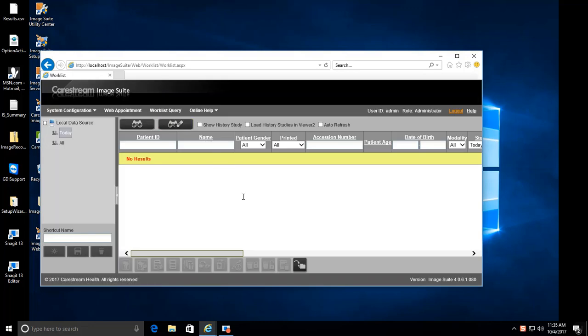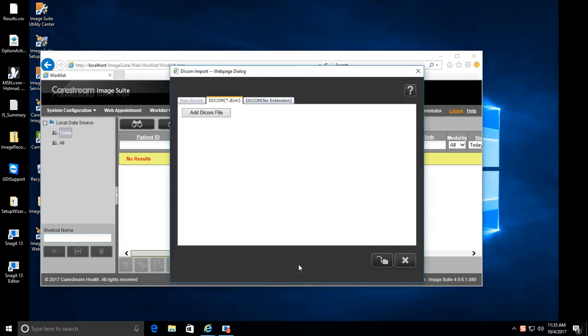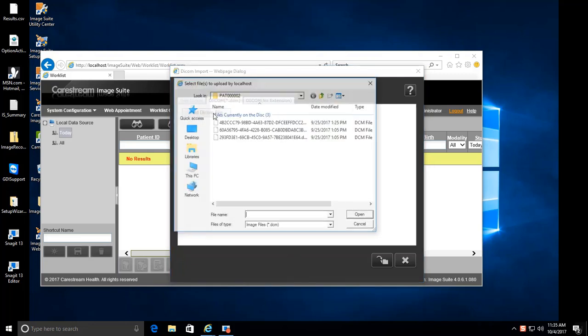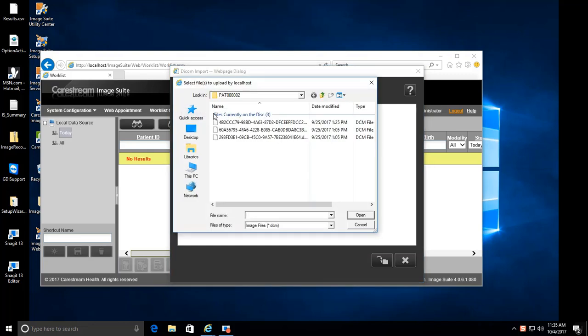Select the Import icon at the bottom of the screen. The DICOM Import dialog box will appear. Click on the Add DICOM File button. A new dialog box will appear.